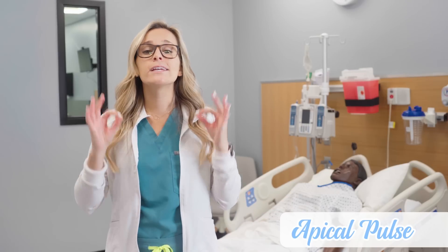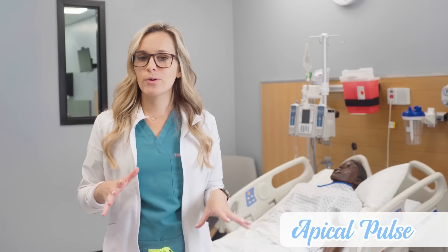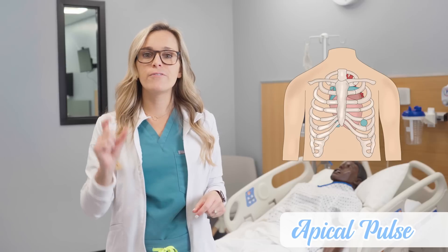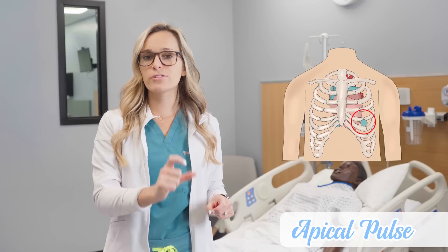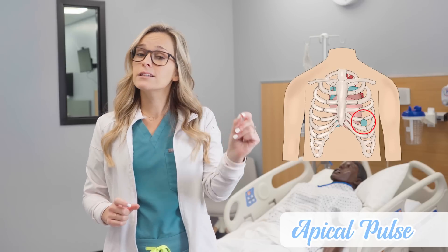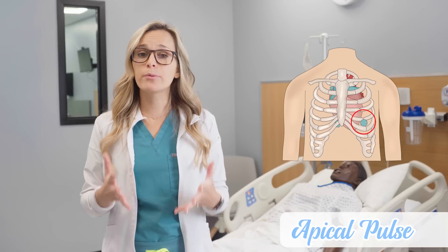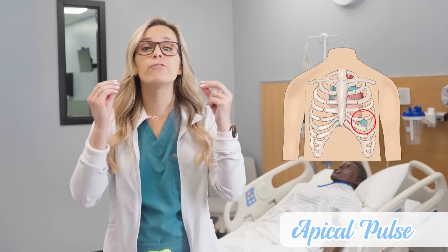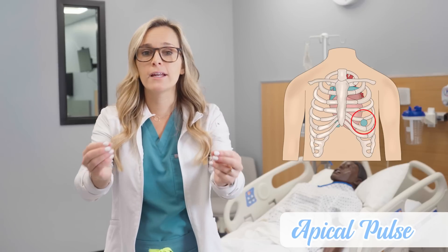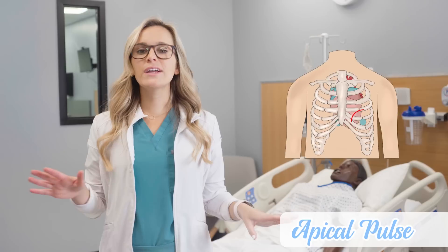Next we have the apical pulse. This can only be assessed with a stethoscope. The apical pulse is located at the 5th intercostal space at the left mid-clavicular line. You always want to count the apical pulse for a full minute, whether the patient has a cardiac issue or they don't.